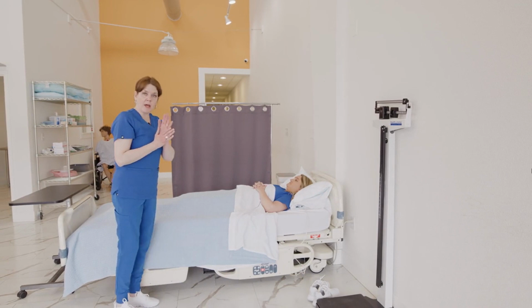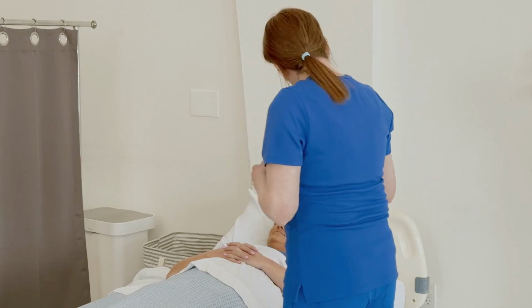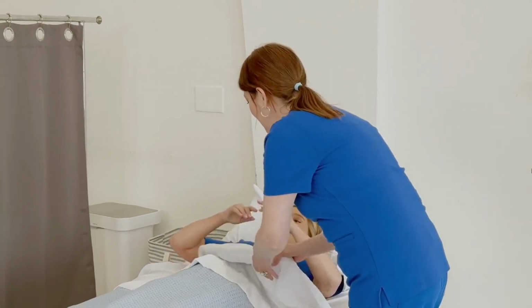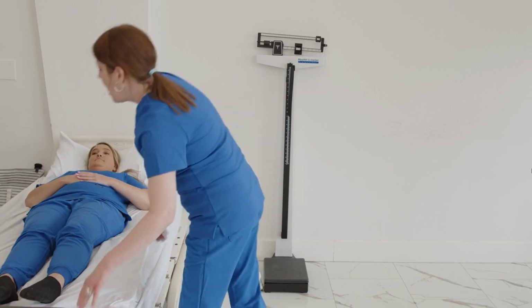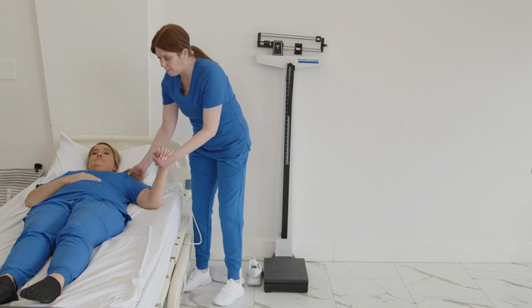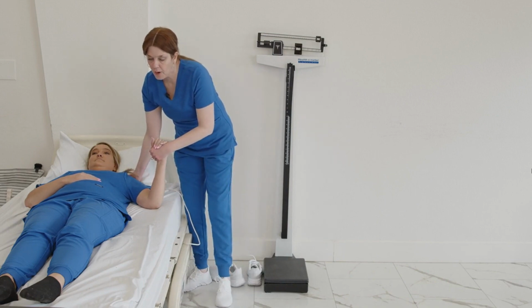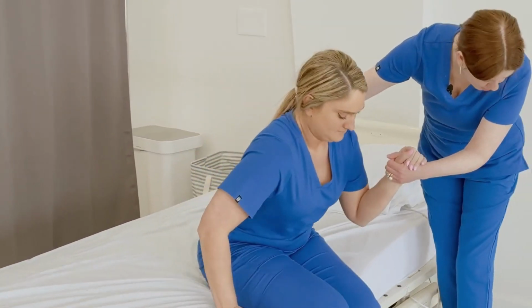I'm going to wash my hands, always before touching my patient. And then I'm going to uncover you and we're going to sit up to the side of the bed, okay? So again, making sure that you're clearing your patient's feet. And I'm going to take this hand, we're going to go behind your shoulder. Count of 3, go ahead and sit up and swing your legs off the side of the bed. 1, 2, and 3. Put your feet flat on the floor for me.